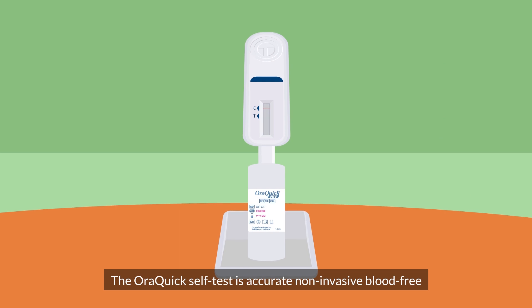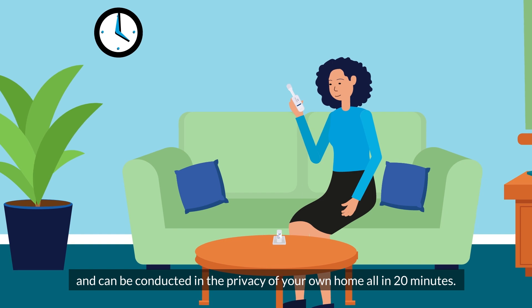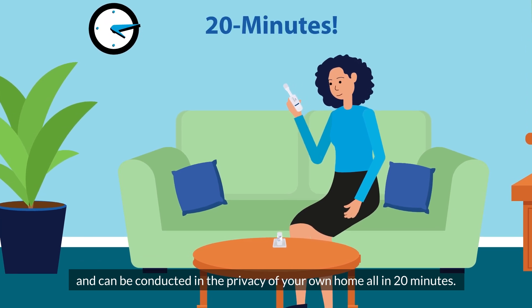The OraQuick self test is accurate, non-invasive, blood-free, and can be conducted in the privacy of your own home — all in 20 minutes.